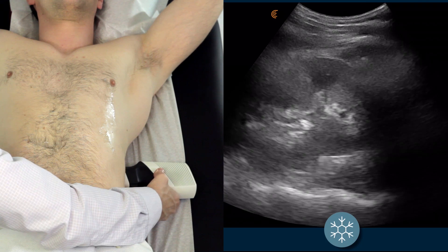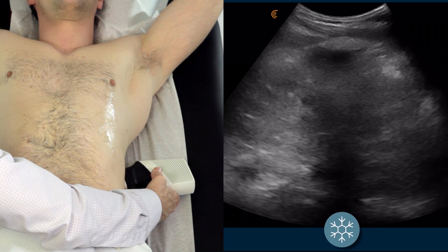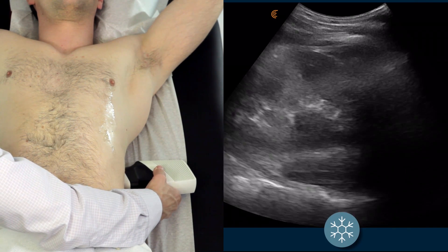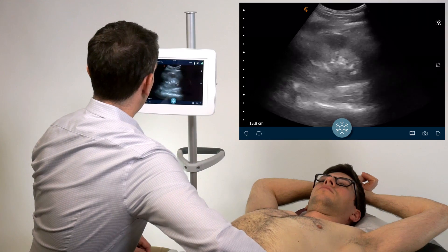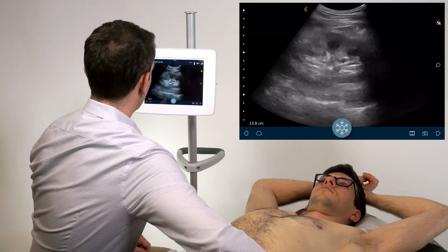Again, starting with the probe low on the body to identify the left kidney. If you have the same problem with the rib shadow, a slight counterclockwise rotation of the scanner will clean that up. Slowly sweep anterior to posterior, looking for any signs of hydronephrosis or kidney stones.